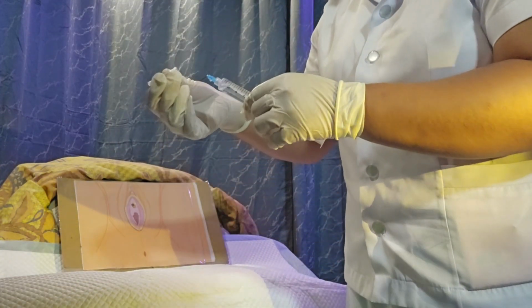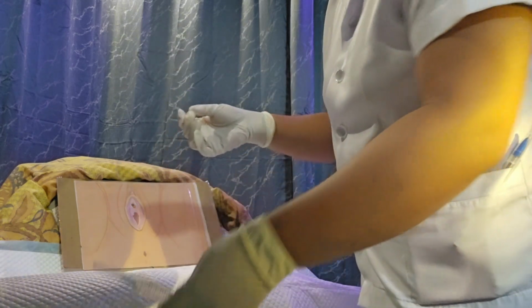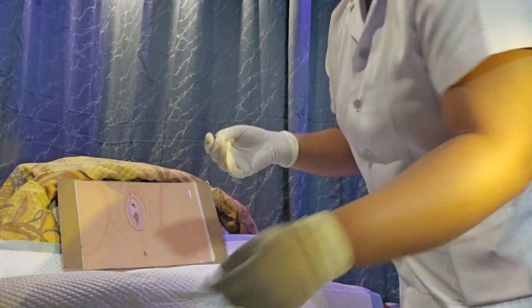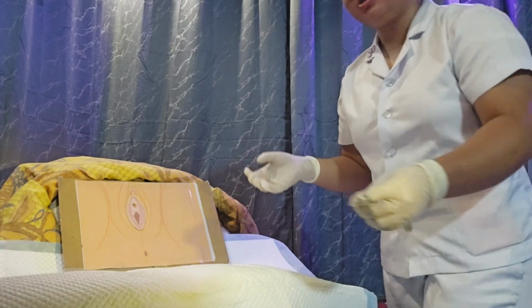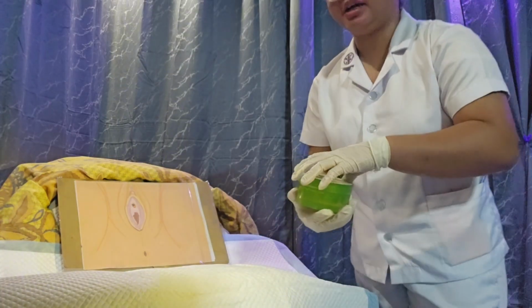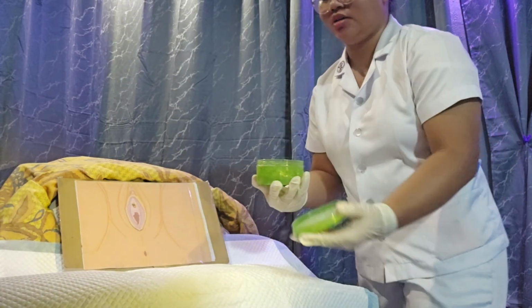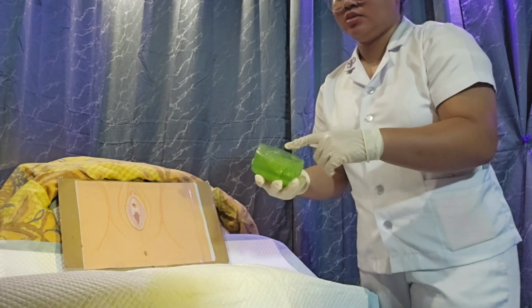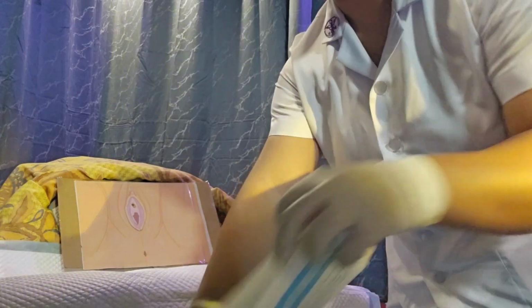catheter 2.5 to 5 centimeters, and also ensuring that we do not plug the drainage eye to also ensure that the urine flows thoroughly and smoothly. So we are going to open the catheter first.